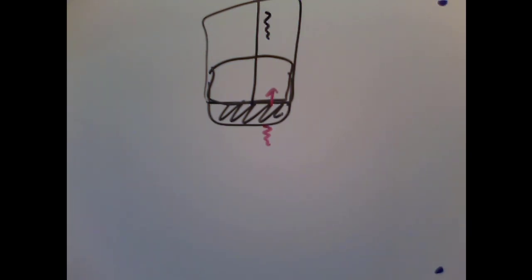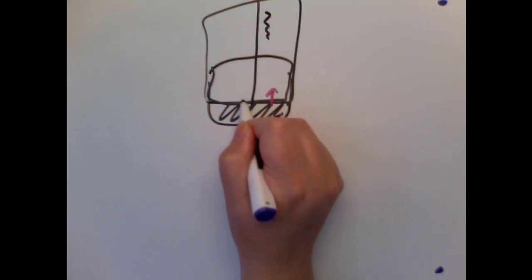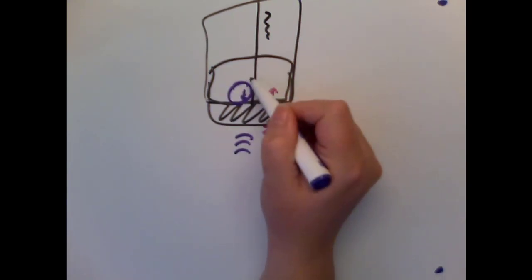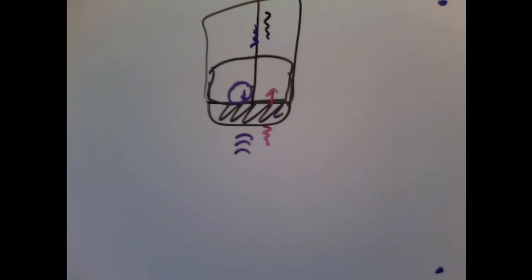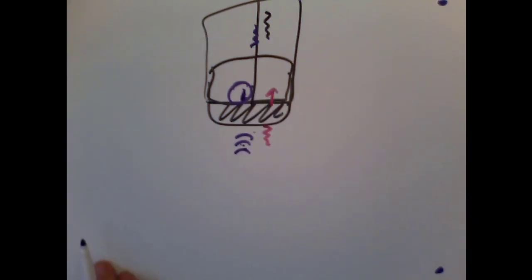During reception then, our sound waves are coming back, right? It's going to create an electrical current in the transducer. Some of that will be absorbed by the backing material, and then some will continue on through the wire. But these are really, really weak echoes that are coming back, so we're going to get really weak electrical voltages.